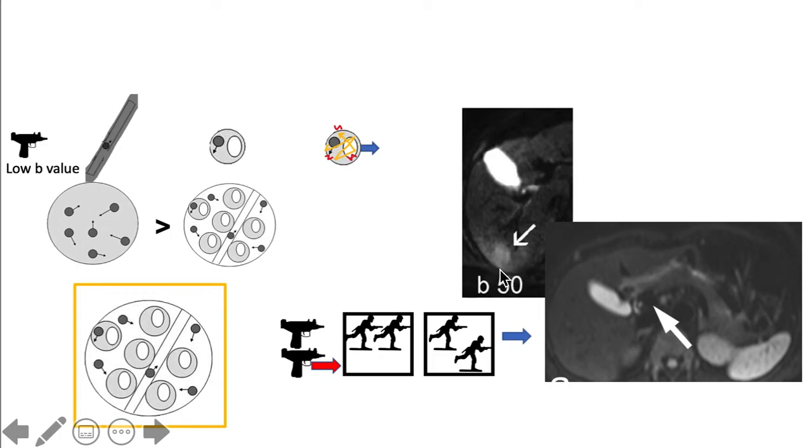However, notice that the tumor remains bright. Also notice there is a part of the liver parenchyma where we are not sure if this is part of the diffusion or the normal parenchyma. At low B value, there is not much contrast between the tumor and the normal cell.